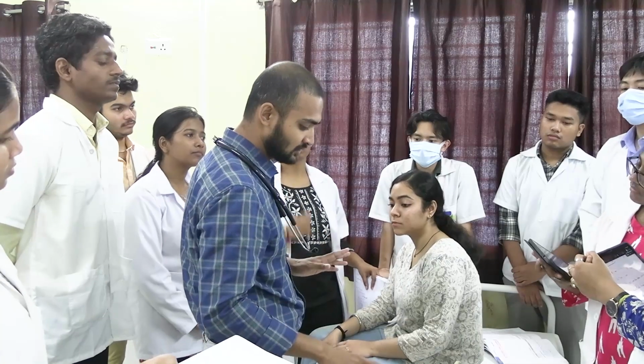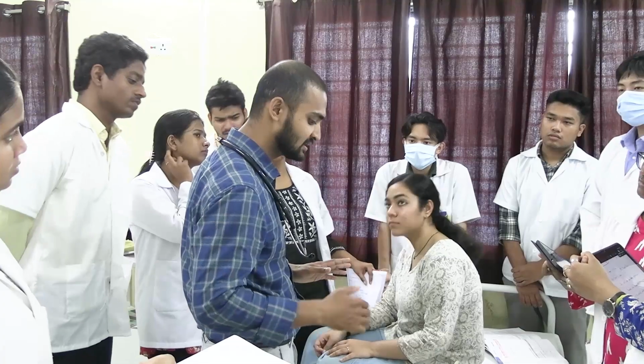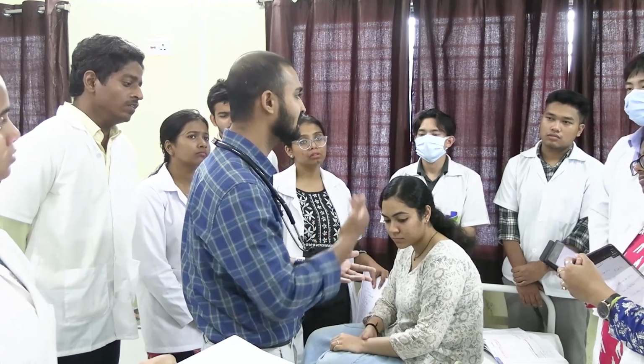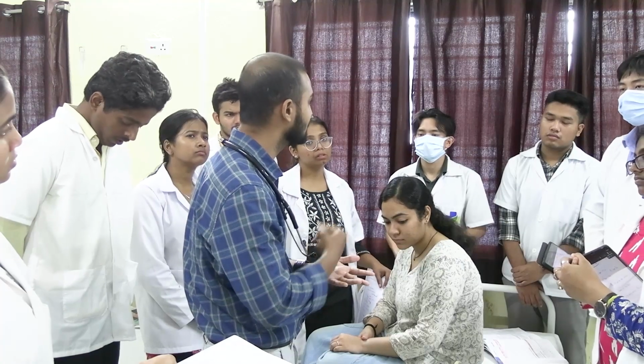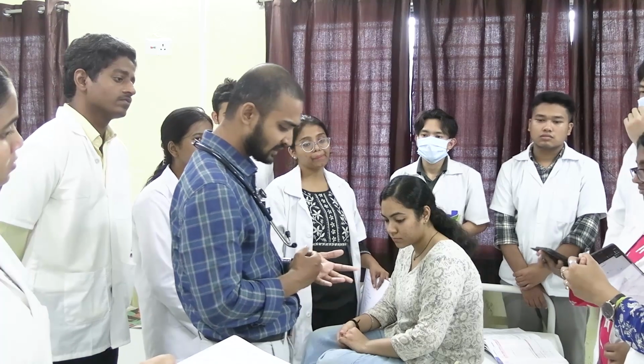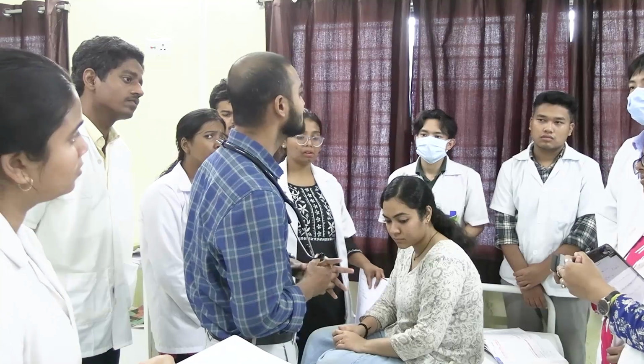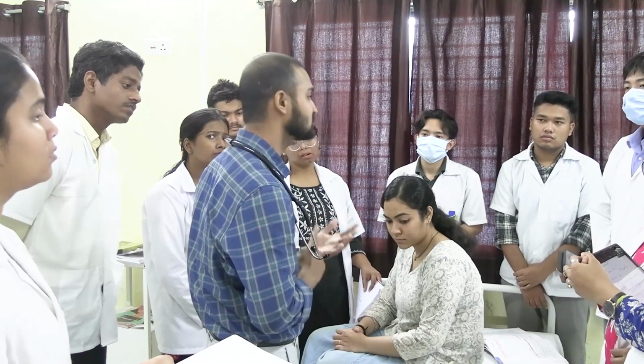So when I increased her BP, when I inflated it till 150, I then deflated it at the rate of 1 to 2 mmHg per second. At around 110 I got the first sound. The first sound is the systolic.